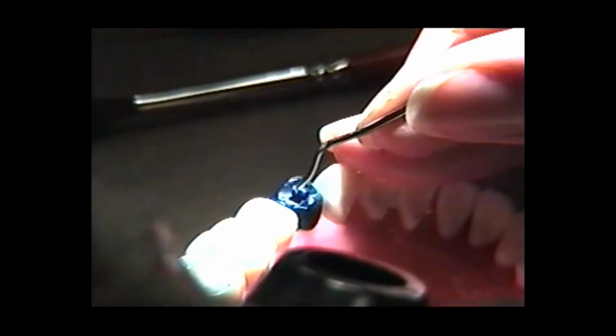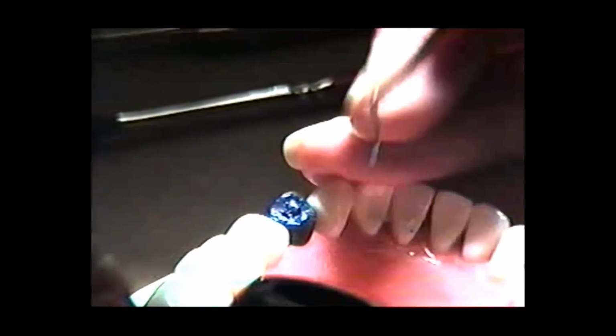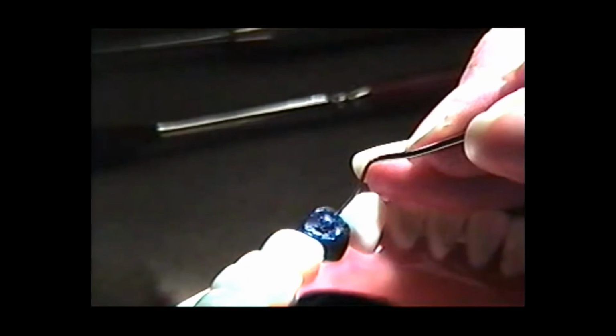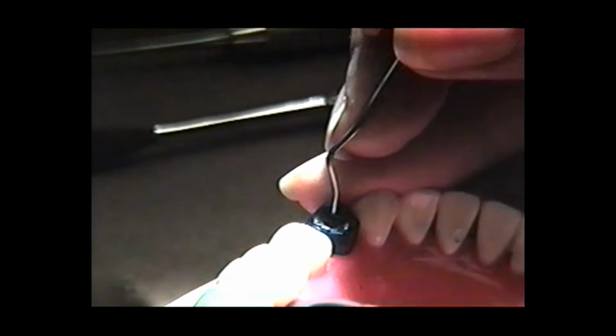I'm not going to spend a lot of time, but as you do this, you'll get practice and get better at it. Just take away the little bits of wax and that'll give you a nice clean occlusal anatomy on this, and a nice finish in your waxing. I come around on the triangular ridges and round them out into the grooves.